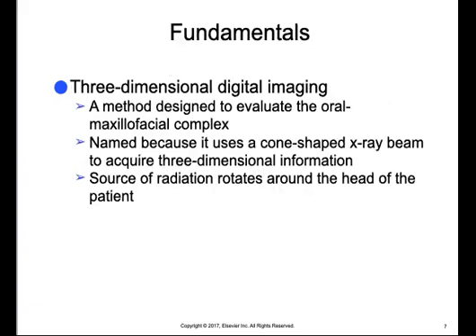Okay, so for years, three-dimensional imaging was primarily used in medicine. Today, manufacturers of CBCT units have developed three-dimensional imaging specifically to evaluate the oral and maxillofacial areas. The CBCT is so named because it uses a cone-shaped X-ray beam to acquire three-dimensional information.